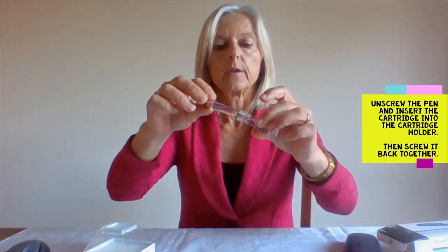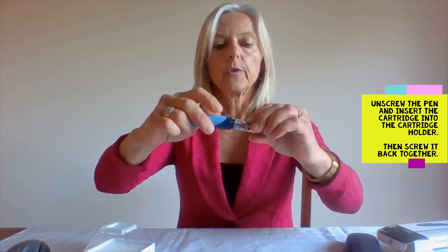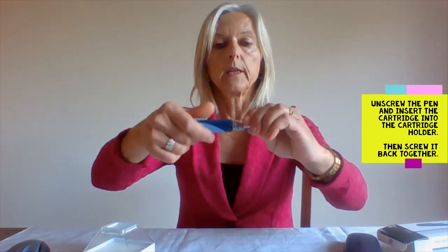To load a new cartridge you first inspect the insulin. Basaglar is a clear insulin, so make sure it's clear with no lumps or discoloration. There's an expiry date written on the bottom of the vial — make sure that's in date. You then unscrew the pen and insert the cartridge into the cartridge holder and screw it up again as tightly as possible.